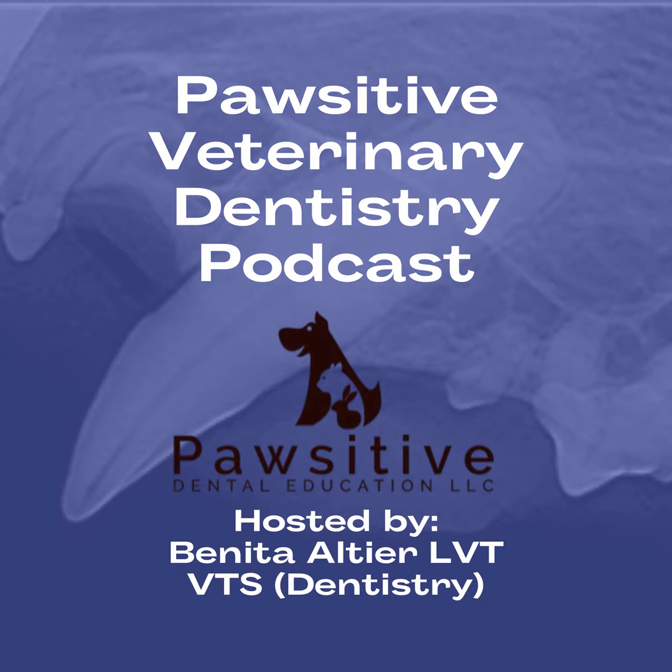Many of my colleagues that have more, unfortunately at Iowa State we don't have cone beam, at least at this point, so using a different imaging modality would also be very helpful. So cone beam definitely gives you that ability to get that 3D image of your 2D structure. So that would also be a great way to try to ascertain whether that truly is pathology or not. But most general practices don't have that. So then we concentrate on the variation of the radiographic positioning, our clinical exam and how that looks, and then that honest conversation with the owner.